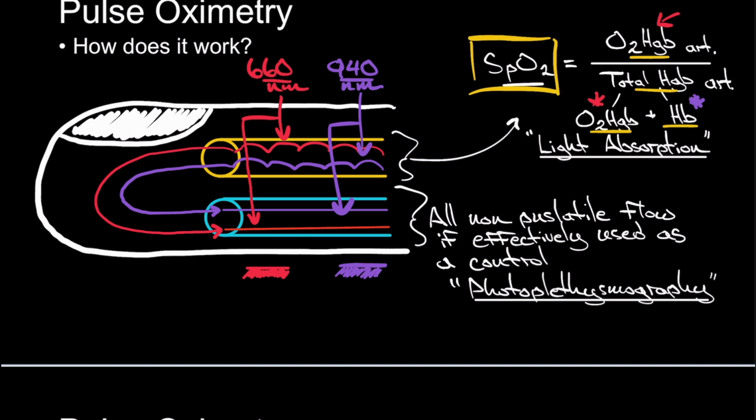There's one caveat to this system that you might get pimped on. So you can see if this is arterial blood flow, this guy right here, I've drawn pulsating waveforms. Both of these, purple and red, are pulsating waveforms. The red demonstrates your oxygenated blood. The purple demonstrates your deoxygenated blood. This is arterial blood flow because it's pulsating. The blood then flows through your capillaries, which I've drawn over here, and then it returns through the venous system. And in the venous system, you have non-pulsating blood. You have deoxygenated, which is in purple. You have oxygenated, which is in red.